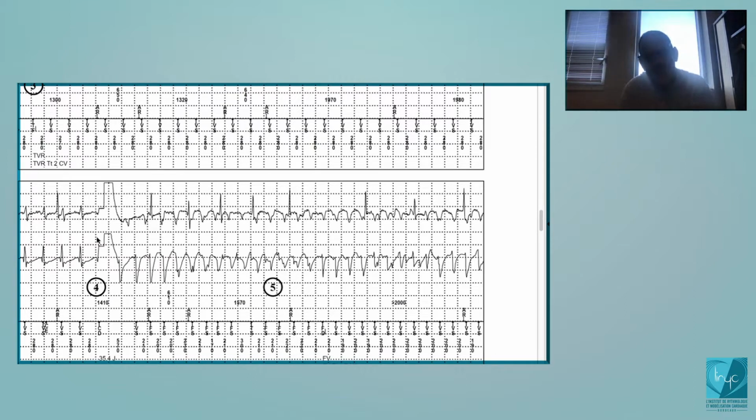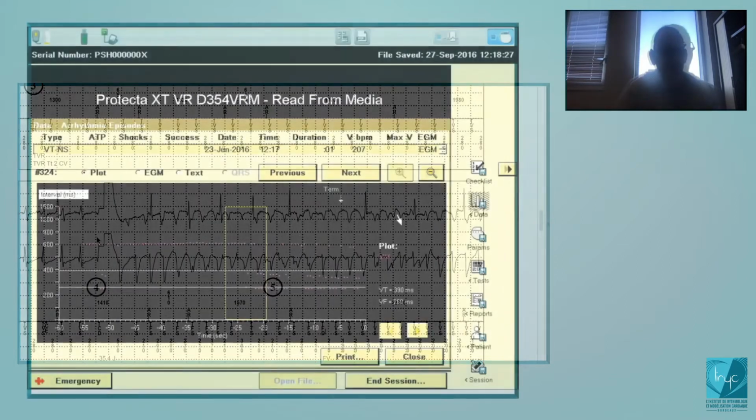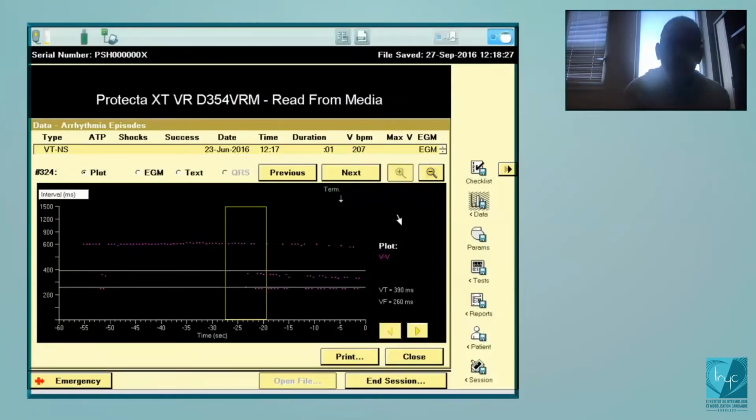Okay, and since today we do not test the defibrillators, at least in our center, we do not know if the patient has or has not a high defibrillation threshold. Therefore, it's a high priority for all patients, of course, to avoid as much as possible the number of inappropriate shocks. Okay, so the subject today will be the problems of oversensing. So what do you think here, Hugo Pierre?